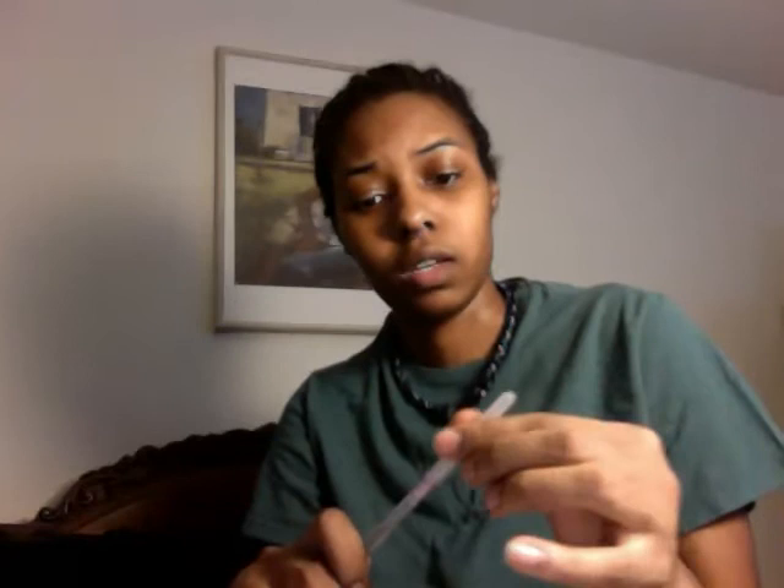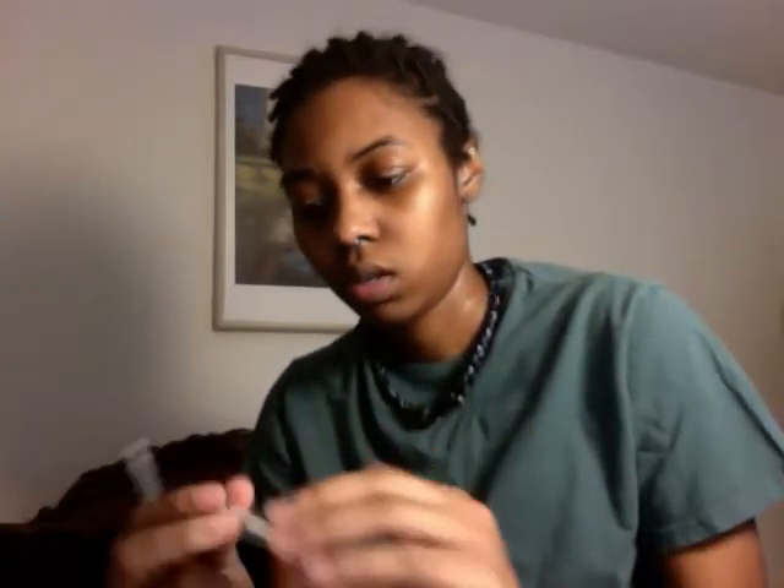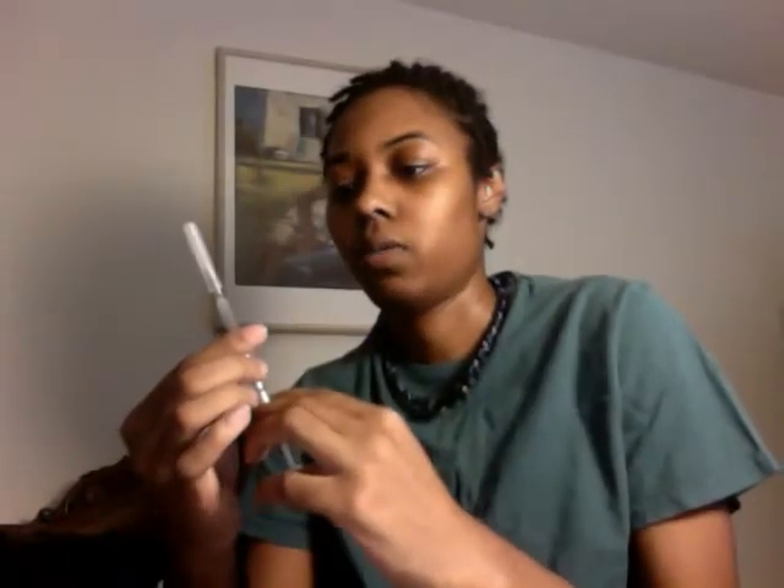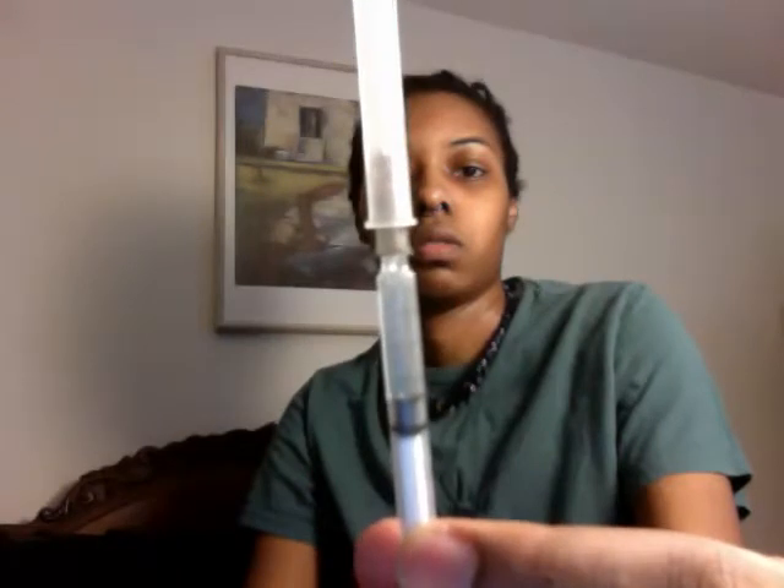I'm going to recap — you're not supposed to recap but these are my needles and I'm not worried about getting stuck — then drop the drawing needle into my sharps container. Then I open my 22-gauge one-inch needle and stick it on. I push my T back up but not all the way, just a little bit while I prep my leg.